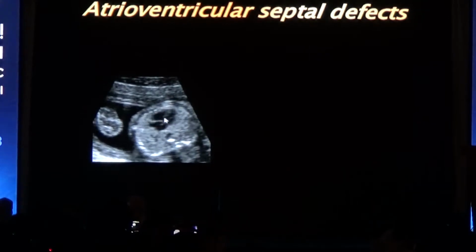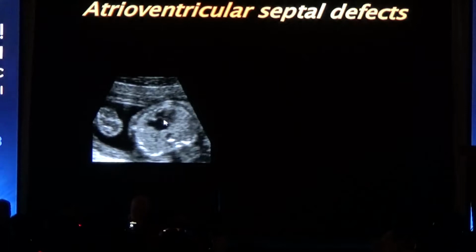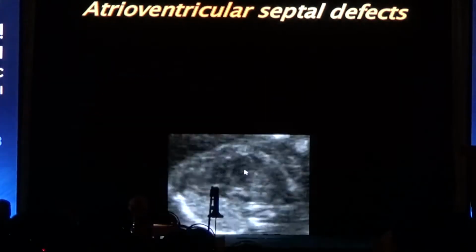Babies that have atrial ventricular defect are missing a portion of the septum on which the atrioventricular node is, and so they have conduction delay and they have a slow heartbeat. You see the crest of the septum. Remember I told you yesterday to look for this white echo that tells you that this is not a dropout artifact, and you see the big valve that is opening over both ventricles.